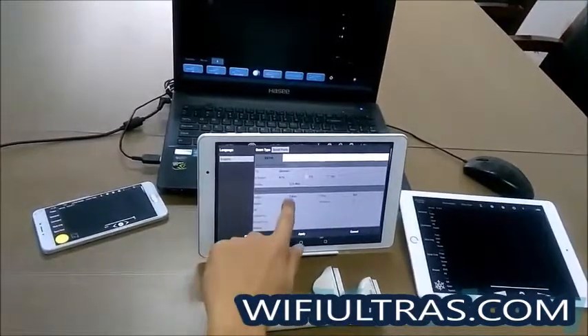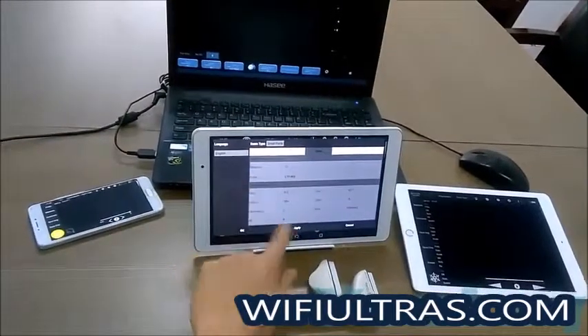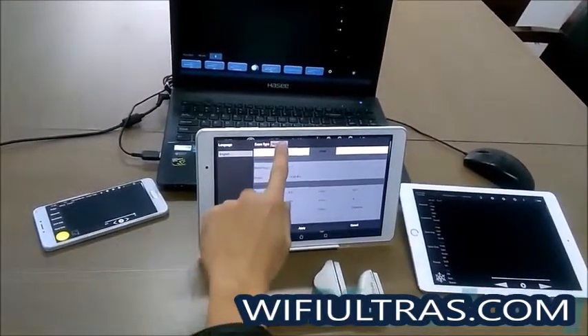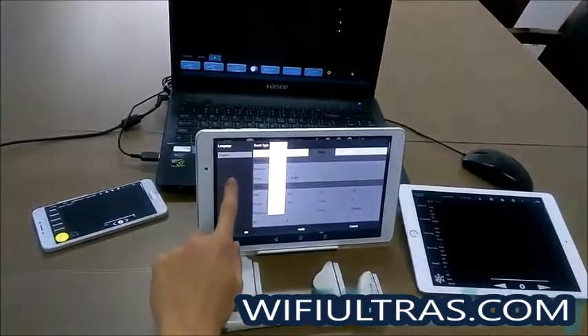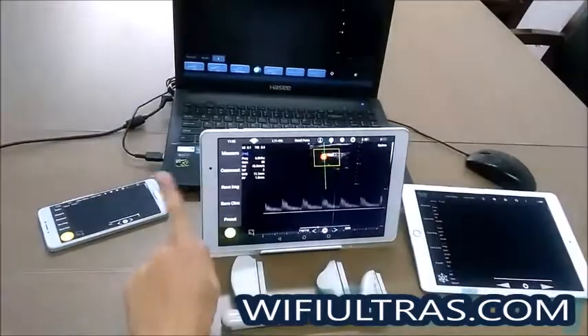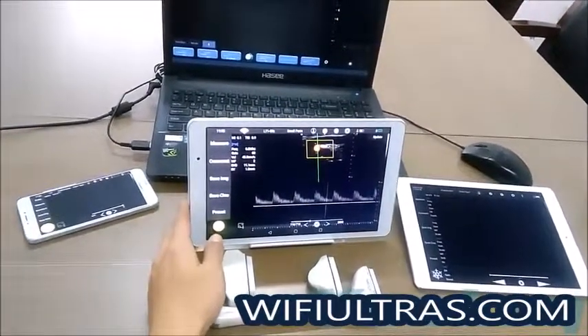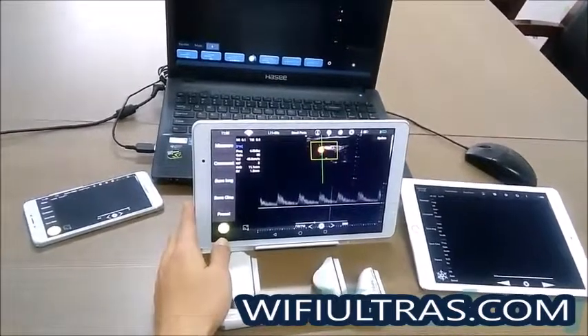You can enter the system preset to change the default parameters and apply them. You can also change the exam type and change the language. That covers the operation for the Android device.